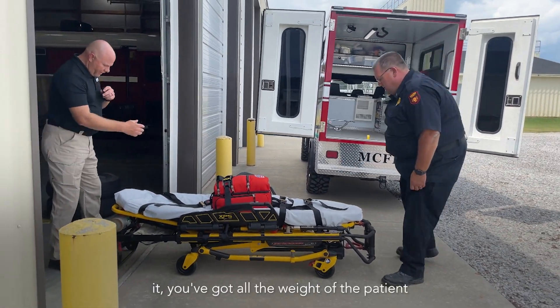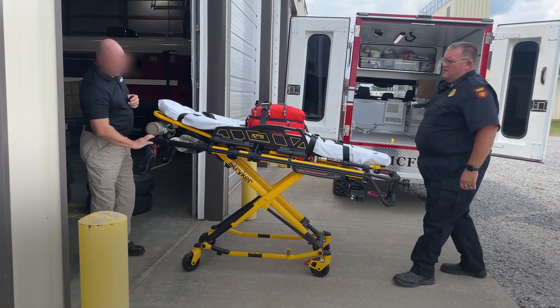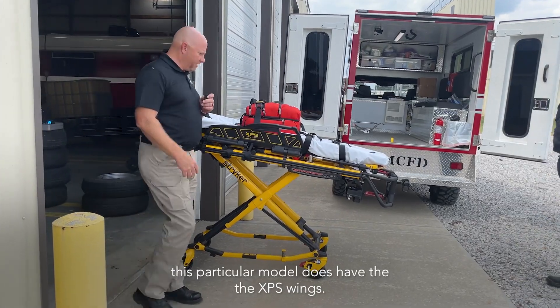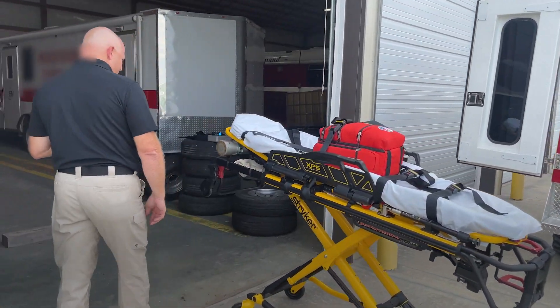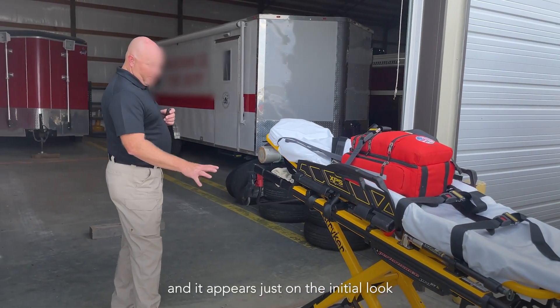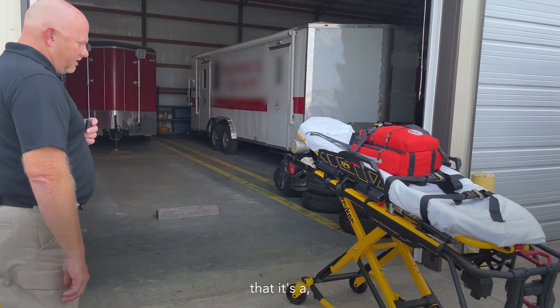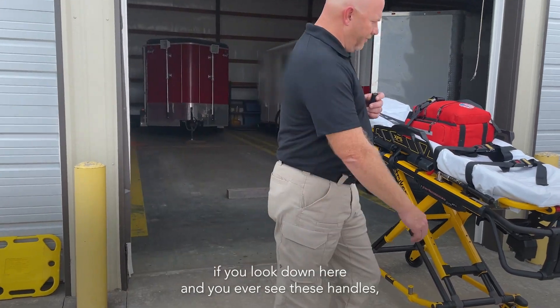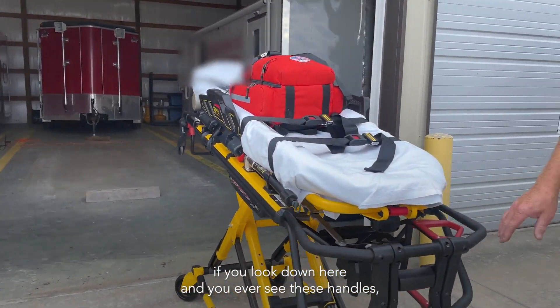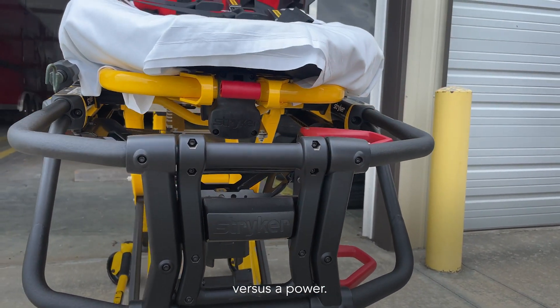When you raise it, you have all the weight of the patient. This particular model does have the XPS wings, and on initial look it appears to be a power pro. But you can tell the difference by looking down here — if you see these handles, that's the indicator that it's a manual stretcher versus a power stretcher.